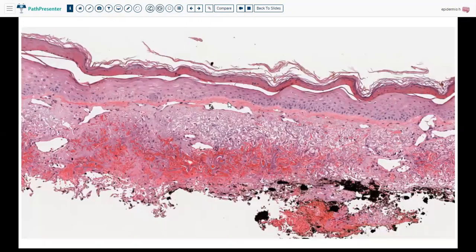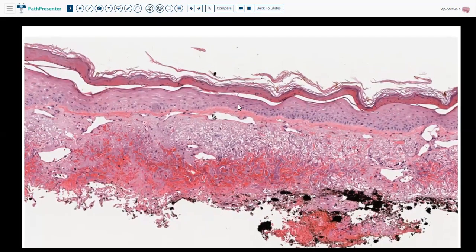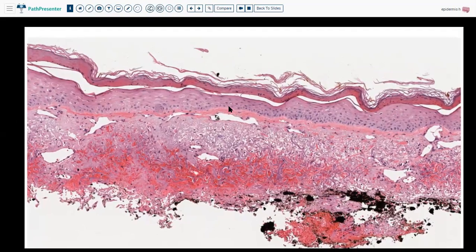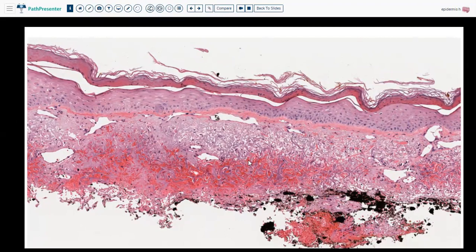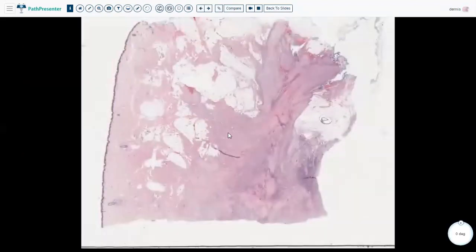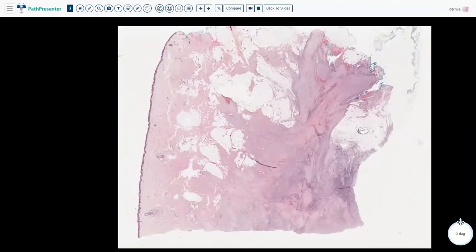Another normal-seeming abnormal feature is here — the skin is very thin, and you would normally say it's atrophic. The dermis is pretty thin as well. But this is also normal because you need to know differences not only in body location but also in terms of age. This patient is elderly. With age, you tend to lose volume in both your epidermis and dermis. This is the case of solar purpura or senile purpura, where older individuals have decreased dermal thickness supporting the vessels, so they bruise easily.